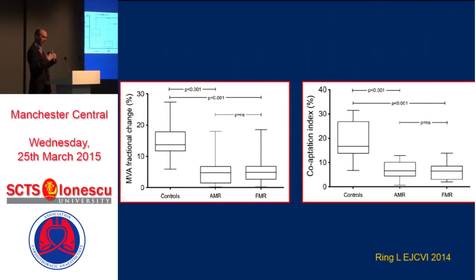There is no difference in the degree of coaptation between the type 1 mitral regurgitation and the remodeled left ventricle of the type 3 restricted motion left ventricle.